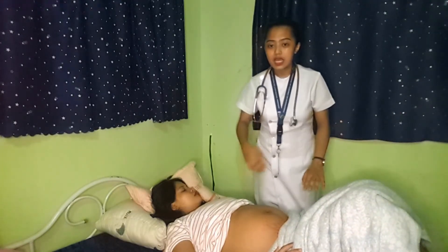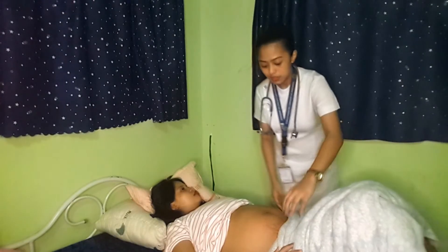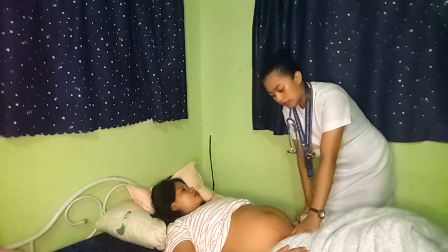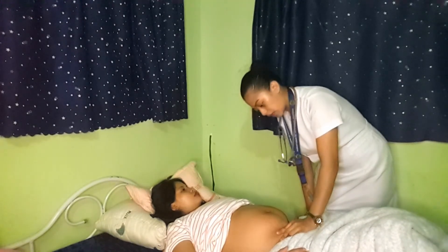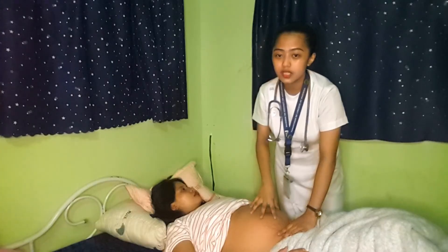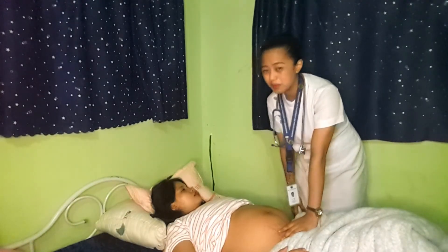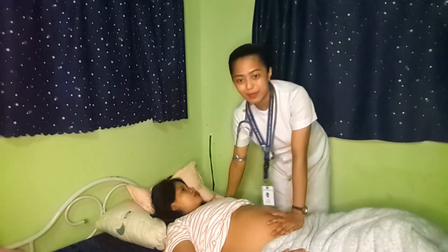Now let's proceed to the third maneuver. In the third maneuver, we are determining if the baby is engaged or not. We need to form an L-shape with our hand and position it near the symphysis pubis. If the baby's head cannot be lifted up, it is an indication that the baby is engaged. However, if the baby moves, the baby is not engaged. For this patient, her baby is engaged.